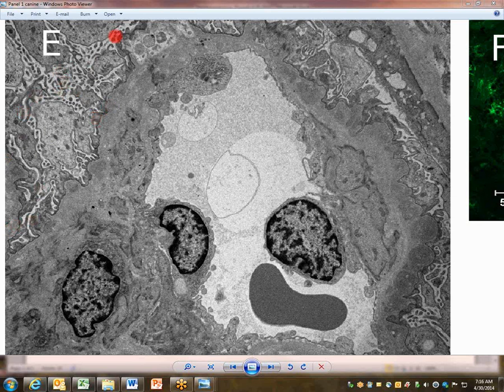Okay. And off-screen is probably some of that podocyte or visceral epithelial cell hypertrophy that you were commenting about before. The other thing is that you're correct about the irregularity of the thickness, but the irregularity is mostly on the subepithelial or abluminal surface, and is attributable to the response of the GBM matrix production by the cells in the field, in this instance, for instance, surrounding the electron-dense deposit, and here as well.